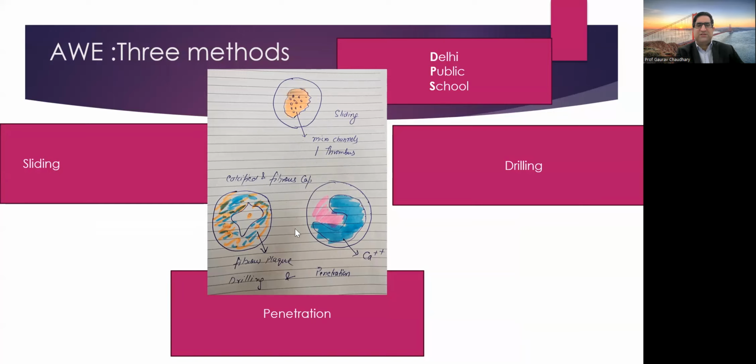And with this picture, we can see if it is a fibrous plaque and it is hard, then of course many times drilling would be required, using moderate to high stiffness wires.